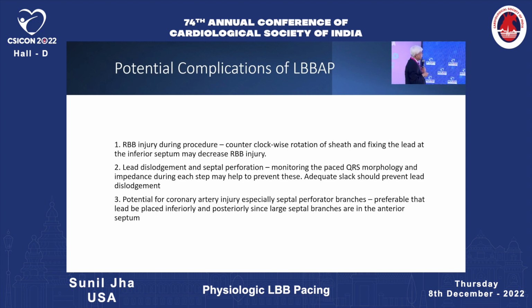For lead dislodgement and septal perforation, monitor the paced QRS morphology and impedance. As Dr. Sunil showed, if you have a sudden drop in the impedance to less than 450, think that you are in the left ventricle, you have perforated. Monitoring during each step may help to prevent this. Adequate slack should prevent lead dislodgement.